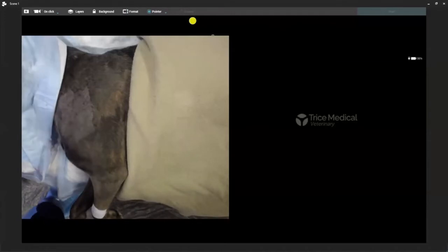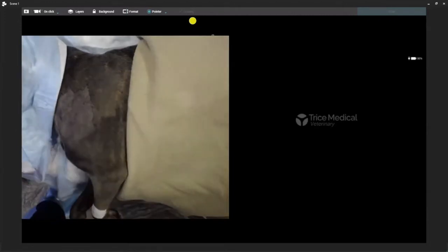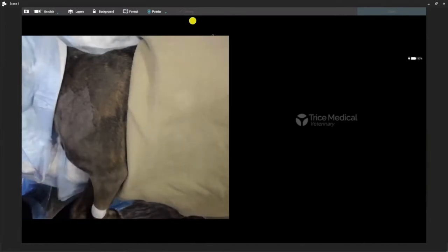Right now, this is a dog patient that's in lateral recumbency. This is going to be the left side — the left shoulder. We're going to start with that. Right now we're just on a table, positioning-wise, very similar to what you would do in your operating room.